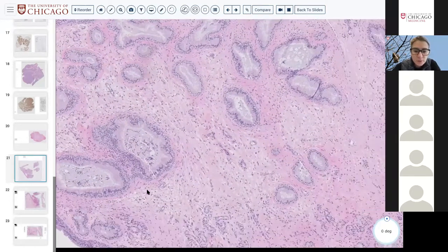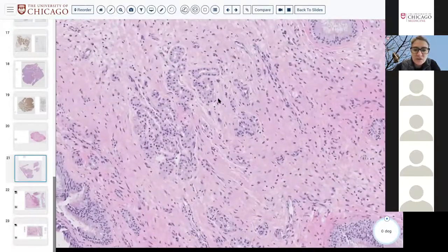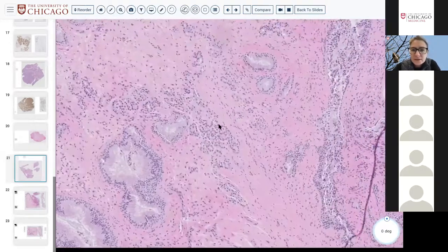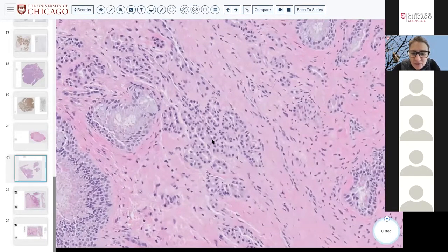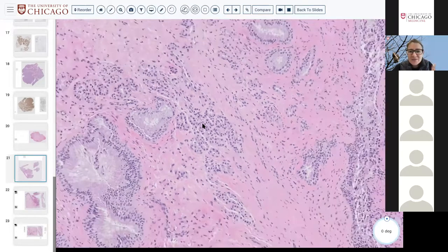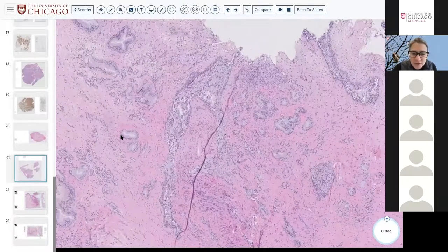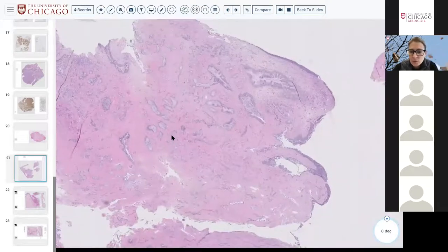The other proliferative feature that you can sometimes see in the stroma is a proliferation of small acinar-like glands that don't necessarily appear very serous or very mucinous, but are nondescript little microacinar proliferations. Those are the main histologic features that you would see in a respiratory epithelial adenomatoid hamartoma.